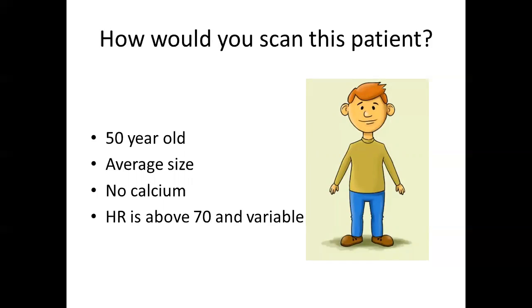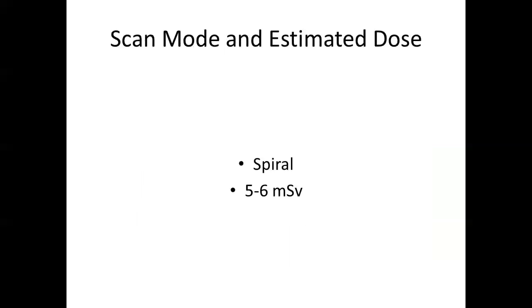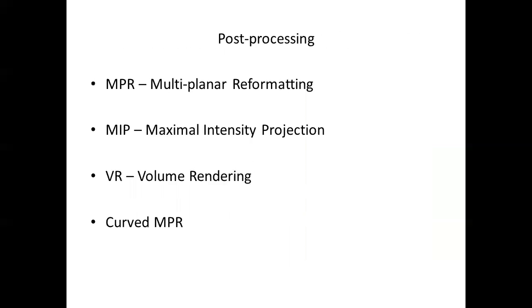Yeah, so that's an option. Sometimes we will cancel and say, take metoprolol for the next couple of days and then come back in a few days. Right. And that's the key here, the heart rate is variable. And once it's variable, then you really need that spiral sequence. And so radiation does go up with that.